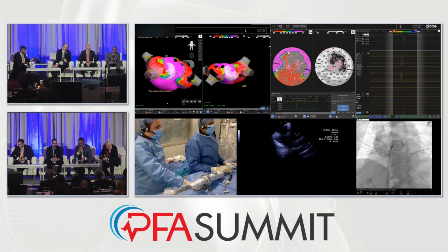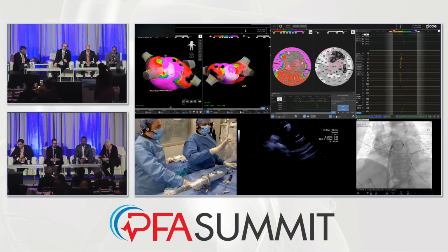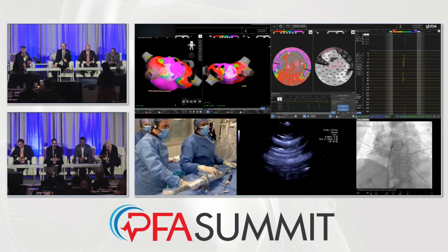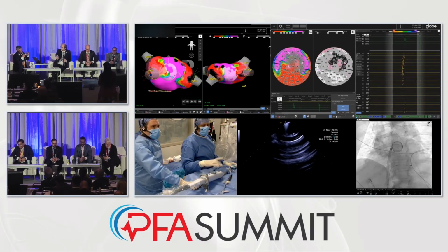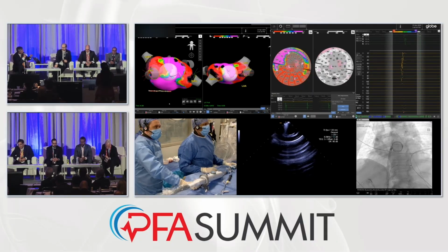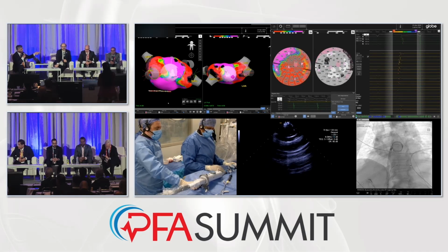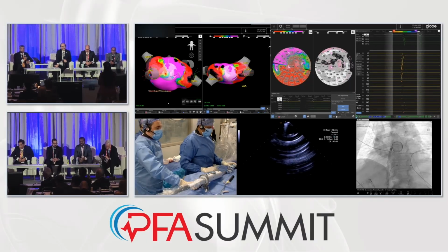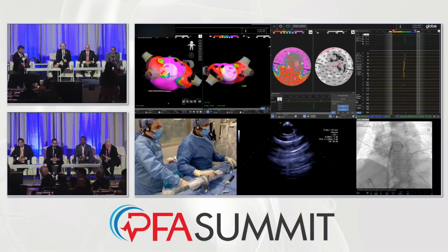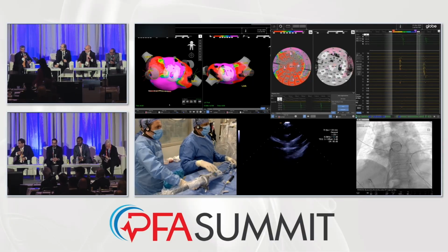I just want to point out, we did the voltage map here. It's just about the catheter, so it's not completely in line with the sheath. There's always a little bit of offset angle, and if you look on X-ray, that's how it is. The sheath is not pointing towards the tip of the catheter. I made one mistake actually, Miguel. The electrograms are filtered through the flow map, so it's when in contact. Your intuition was correct. And the second thing is the vector tells you which direction the globe is going to go when you deflect the handle. Oh, okay. So somebody is paying attention to the vector.